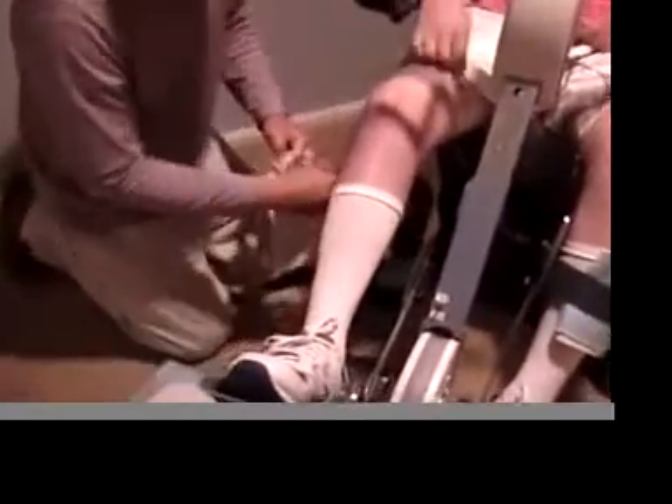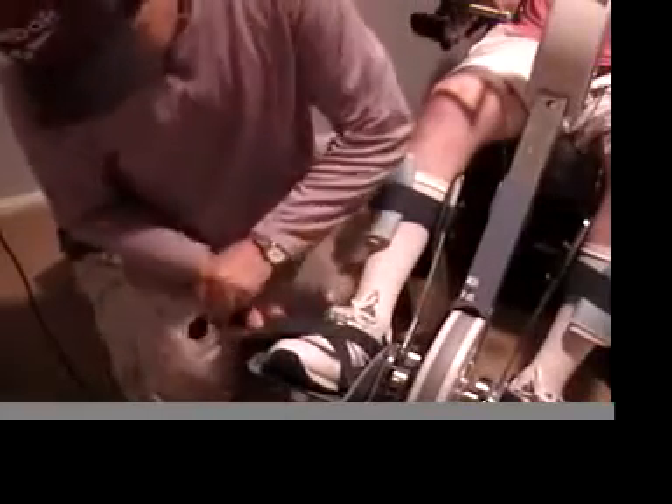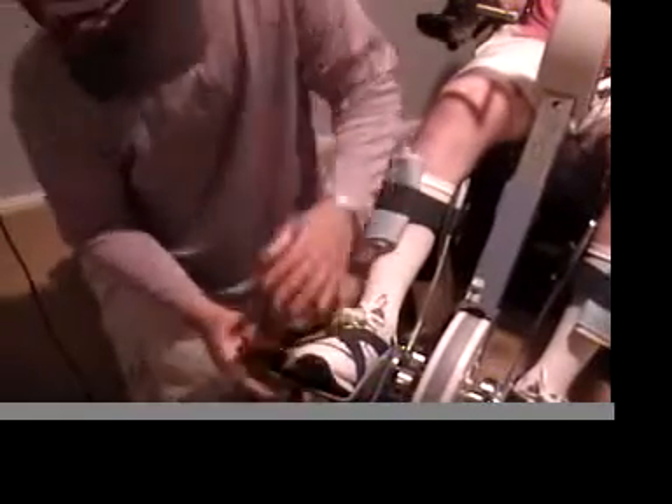Before getting on the bike, you do want to be able to put the electrodes on your butt muscles, which is called your glutes. That is best done in bed, but you can do it in the chair — it just takes some skills.